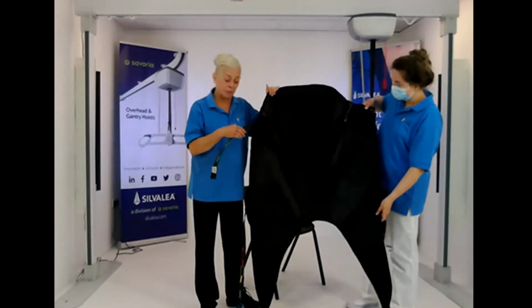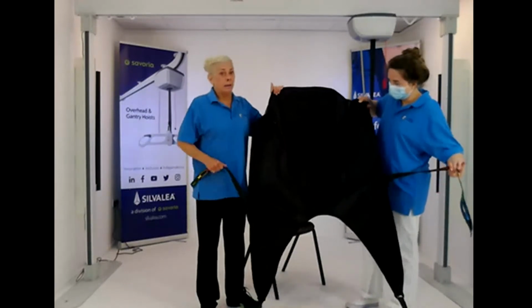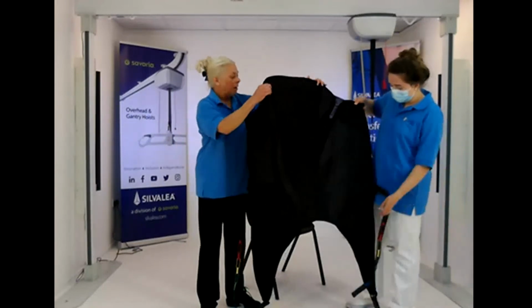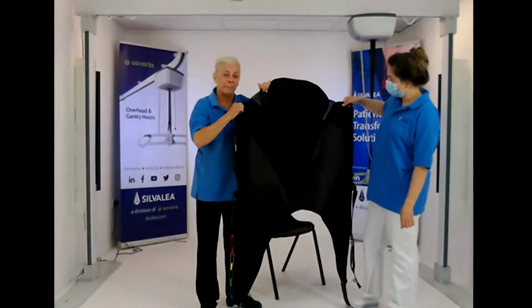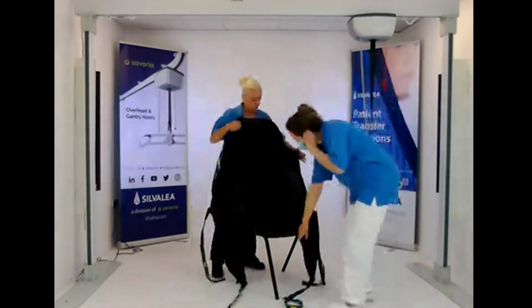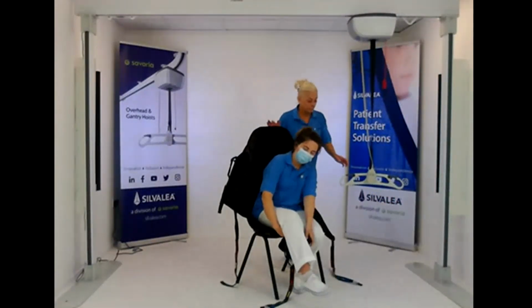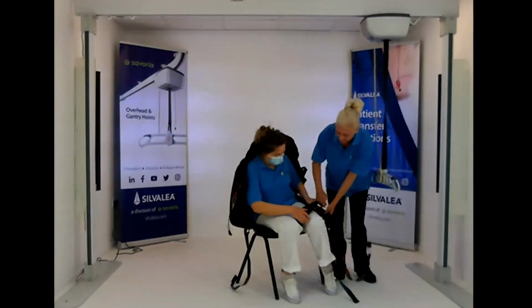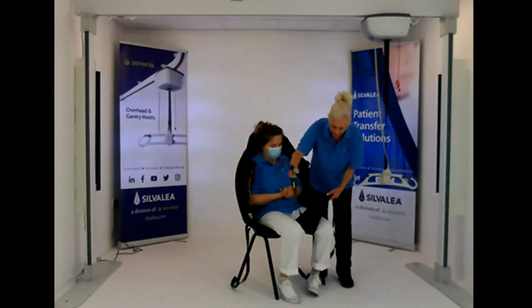So this is a general purpose shape sling with the built-in hip tapes, which will help with lifting and distributing the weight that way. Arched head support, but a little feature of the elasticated side there, which will allow a little bit of movement. Just quickly put this on. The leg sections will have foam in, so they give a lot more support than a standard sling. So it's quite thick, quite bulky across those legs.